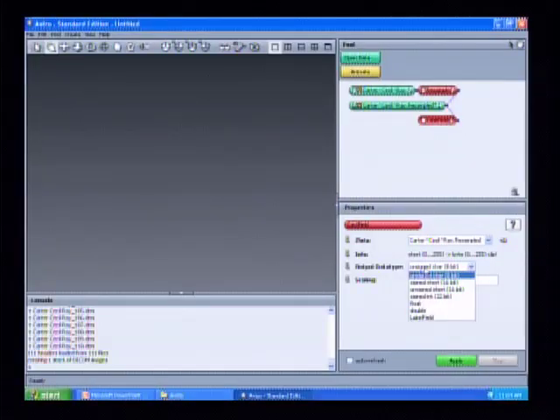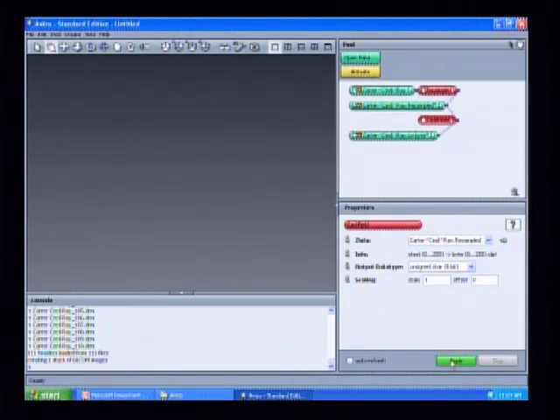We would keep with that unsigned char 8-bit, so you actually don't even have to click on it. This was the option that we were using for this particular data set to try to reduce that metal artifact. But we would just hit apply so this cast field option was applied to our data set as well.